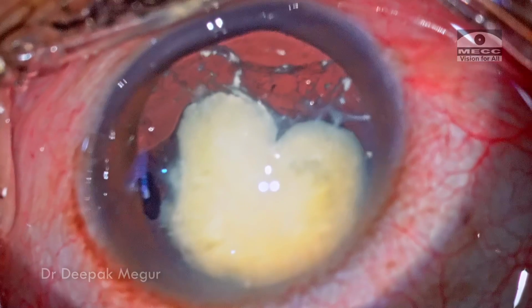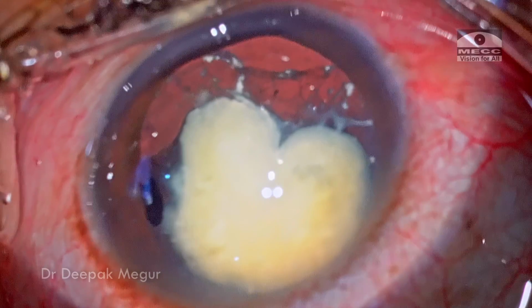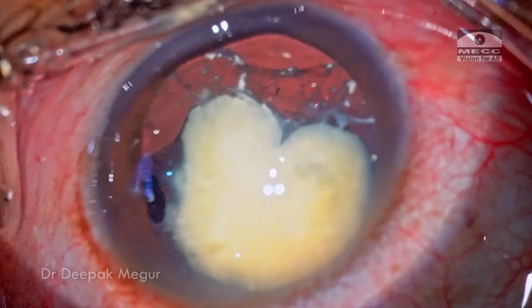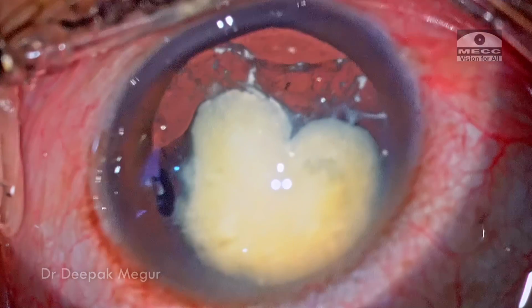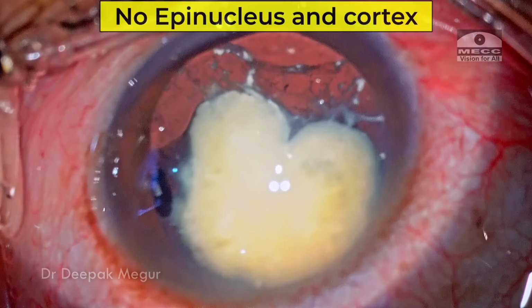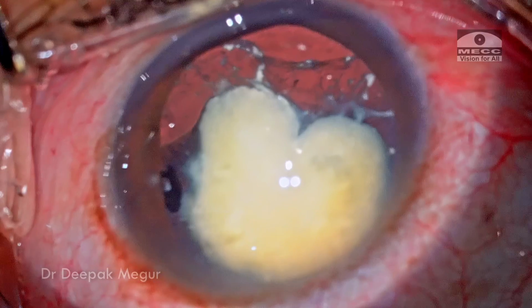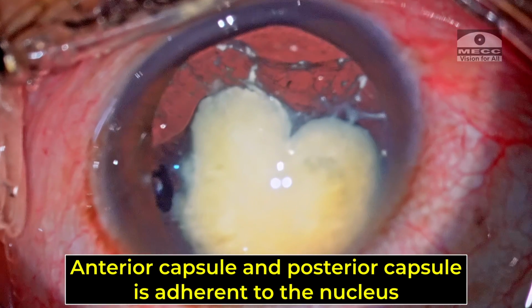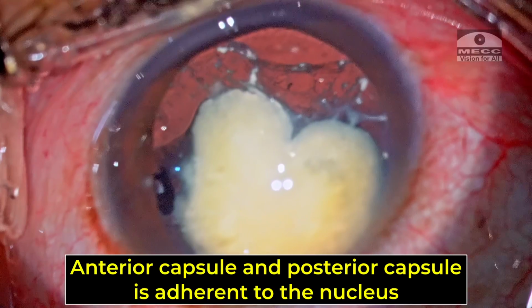Let me try to delineate certain things which I'm seeing here. So this white band is the absorbed cataract. Predominantly it just has the nucleus itself now, so there is no epinucleus or cortex. And most likely the capsular bag is very much adherent. Both the anterior capsule and the posterior capsule are very much adherent to this nucleus.